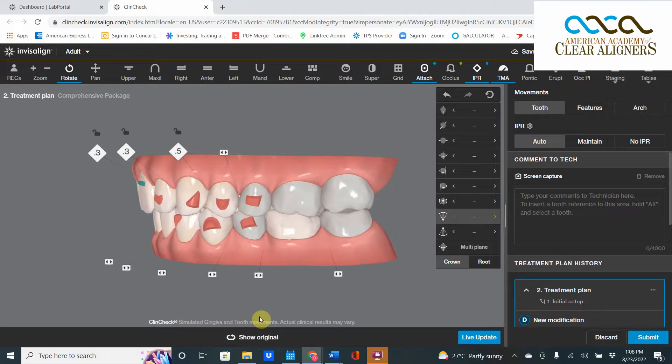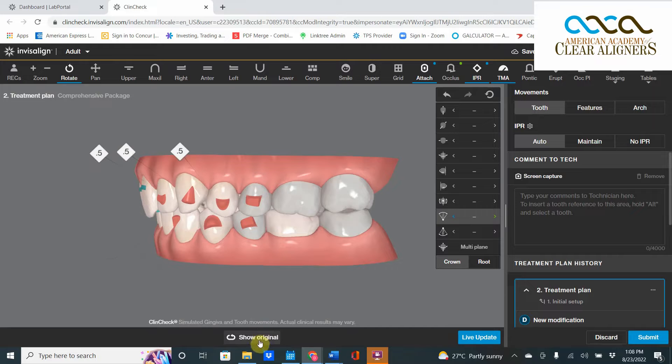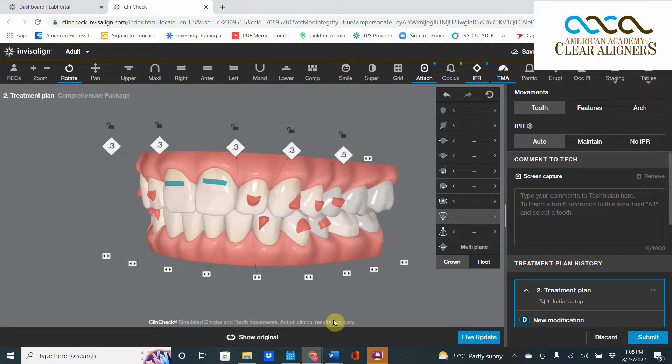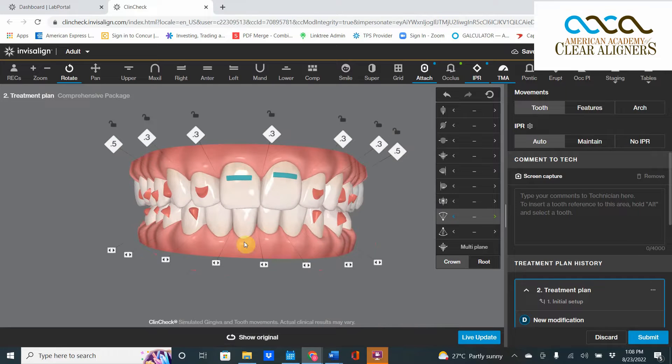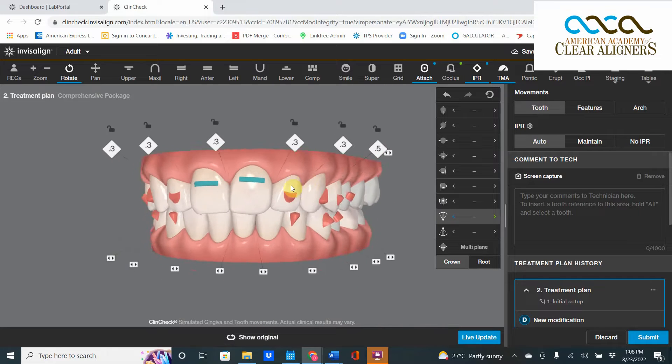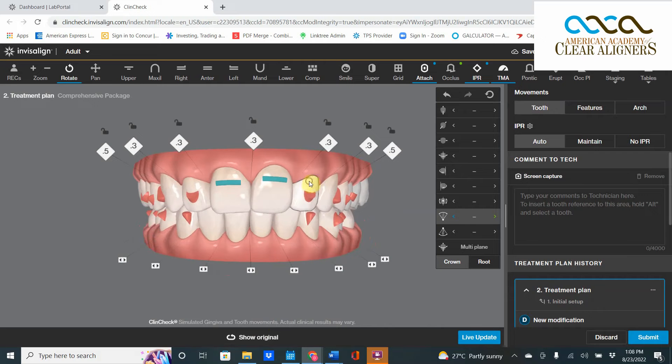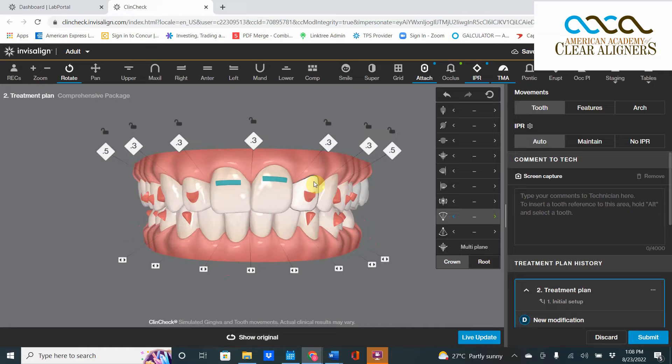Better yet, look at how the IPR changed. We used to have 0.5, 0.5, 0.5, 0.5. Now we just have 0.3 millimeters. Removing lingual root torque can make your cases faster, easier, and more orthodontically correct and reduce IPR.